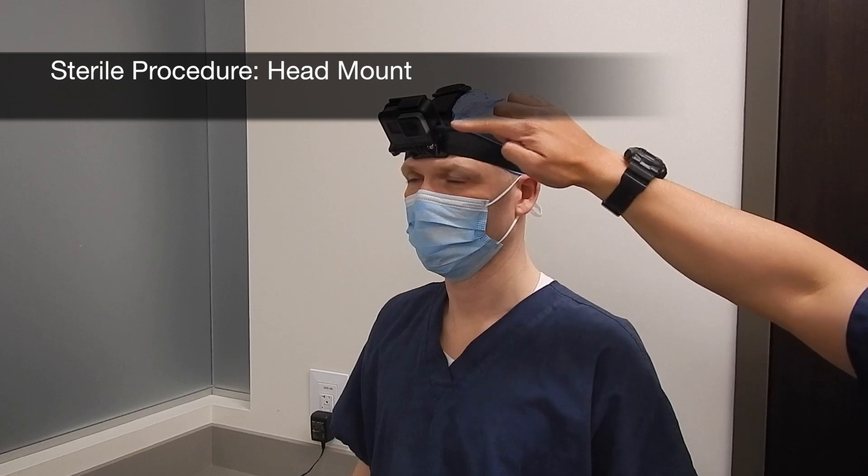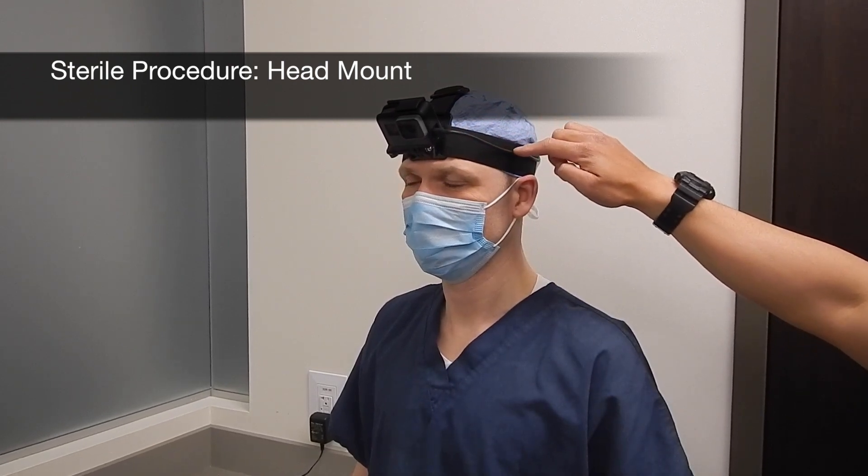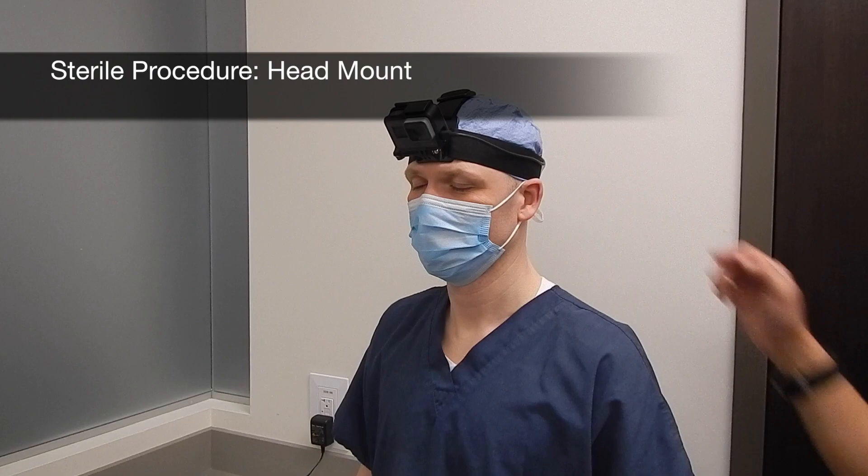For sterile procedures, it is desirable to use the head mount so that the sterile field can be maintained.